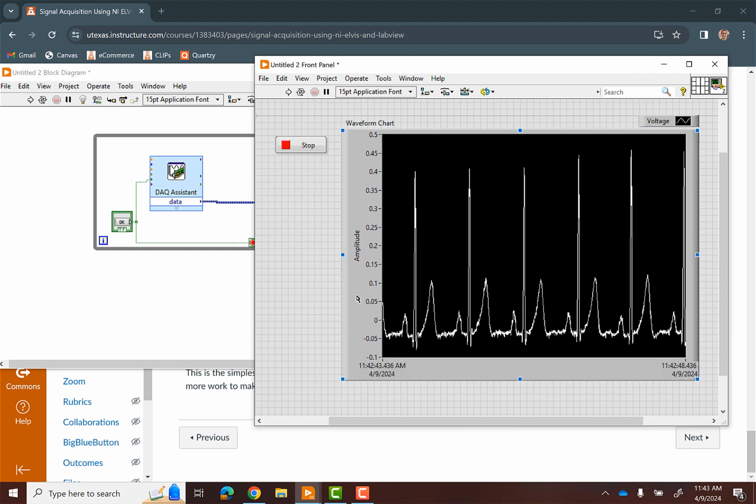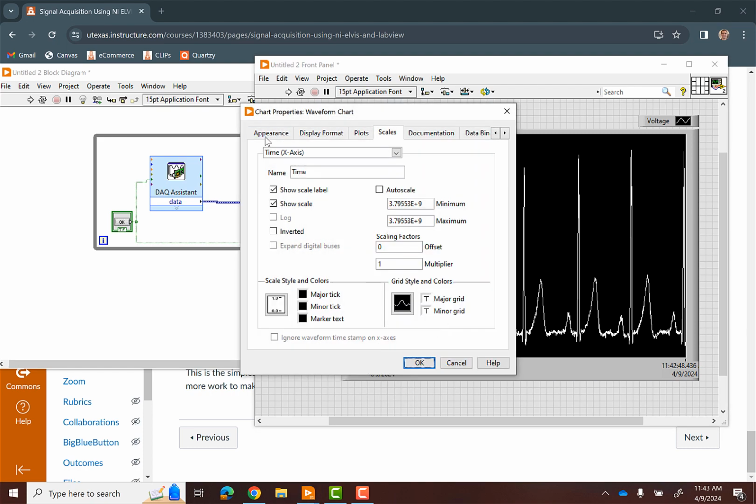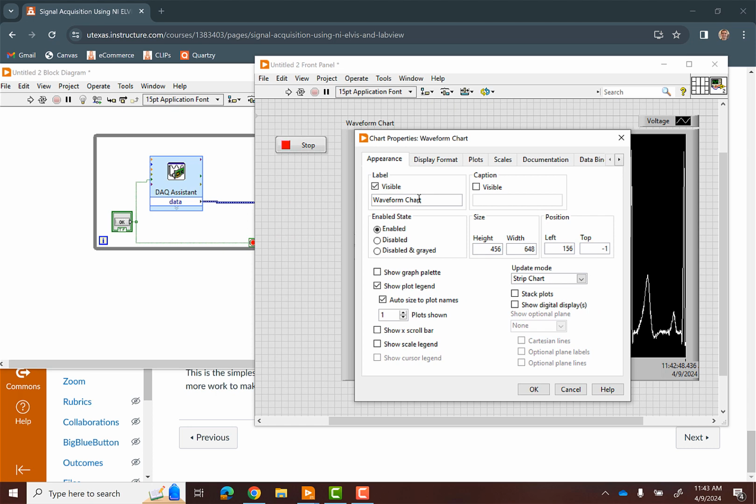And then all the options are basically controlled by right-clicking on this. There's a lot of things you could do straight from this menu, or you just go to properties and it lets you do a bunch of the things, right? So number one, we're going to start with appearance. There's this label, it's waveform chart. I mean, we can make it disappear if we want. But maybe we want to call it something better, right?